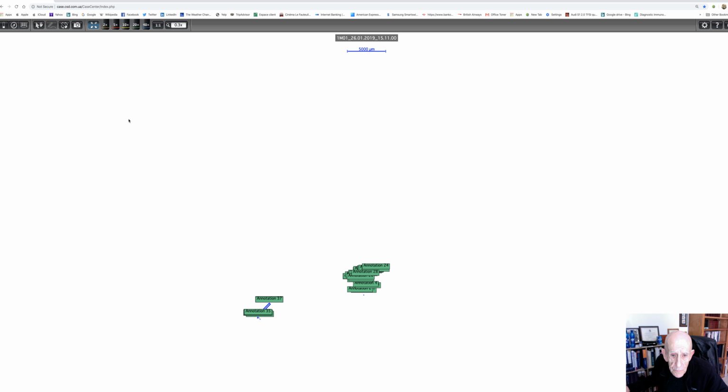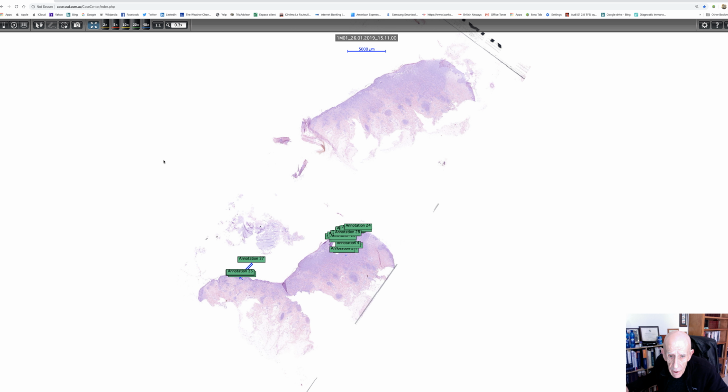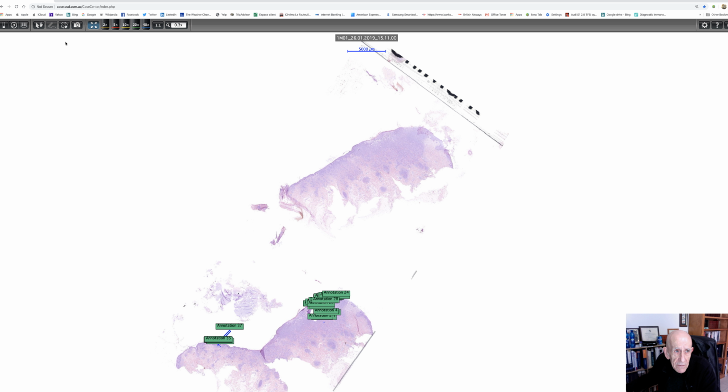And you can see at first glance that there are notations. In fact, in this entire specimen, there are 37 annotations in two different slides, and the annotations conform to the presence of mitotic figures. So before we start looking at this tumor, we know it's mitotically very active.